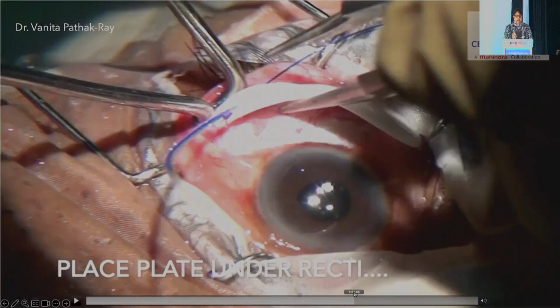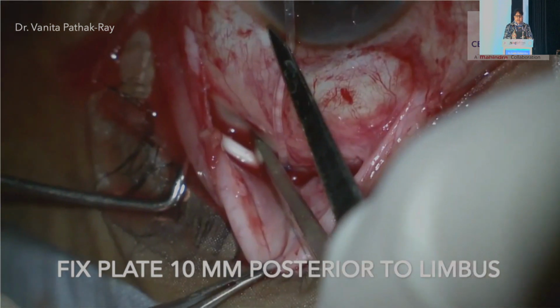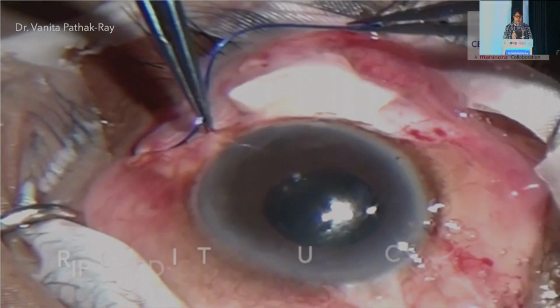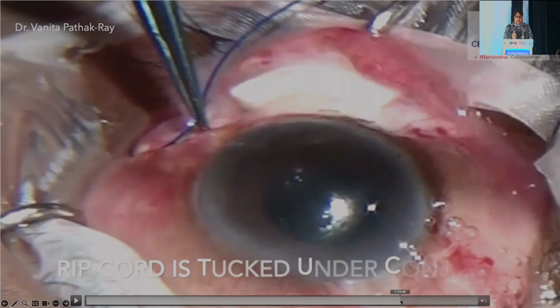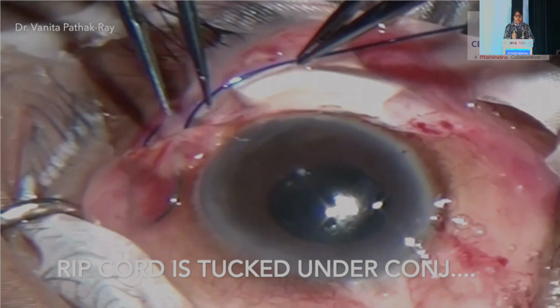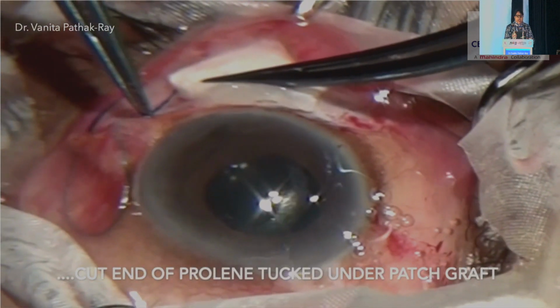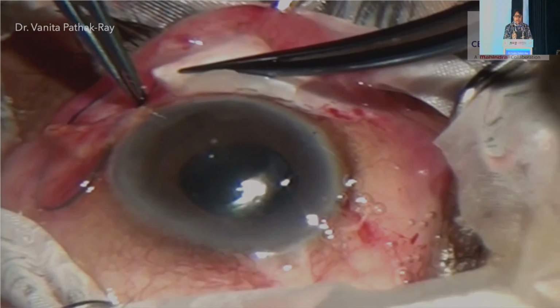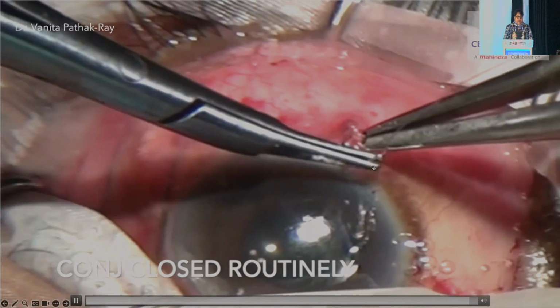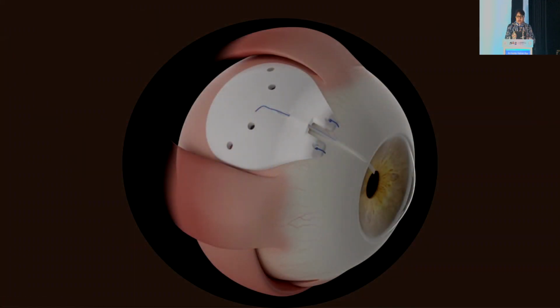I'm not going to take you through it once again. Once the plate is placed under the recti muscle, I fix it 10 millimeters posterior to the limbus, and once that is done, the rest of the procedure is more or less the same. If you have a ripcord, you put it into an inferotemporal pocket, that is if you have a supratemporal implant, and I tuck in the free end under the patch graft. And of course, it's closed routinely. So what are the newer inventions? The ACP250 is very useful for two reasons.